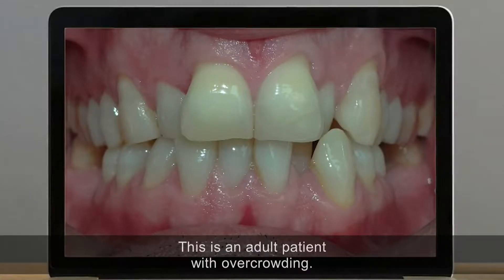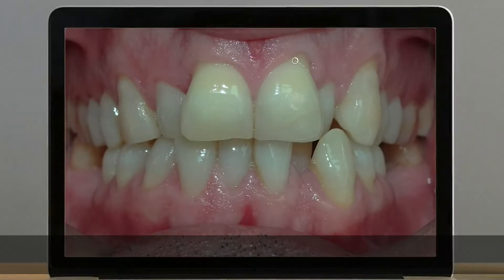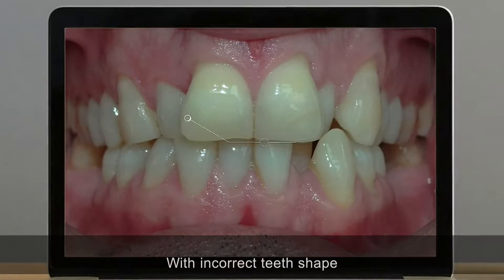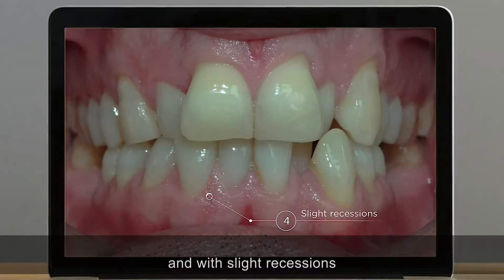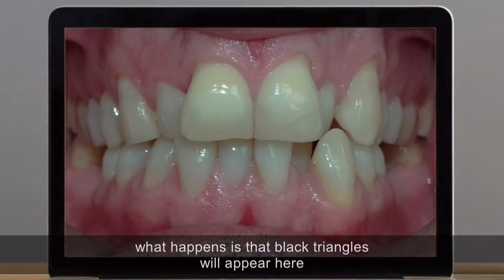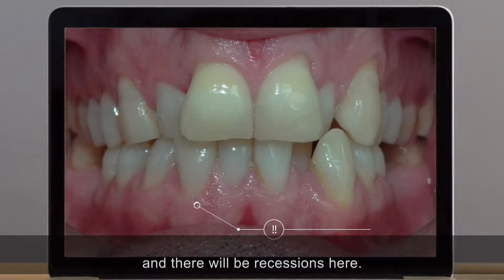Clinical case. This is an adult patient with overcrowding, obvious periodontal problems, incorrect teeth shape, and slight recessions. If we align without previously performing stripping, what happens is that black triangles will appear here, and there will be recessions here.